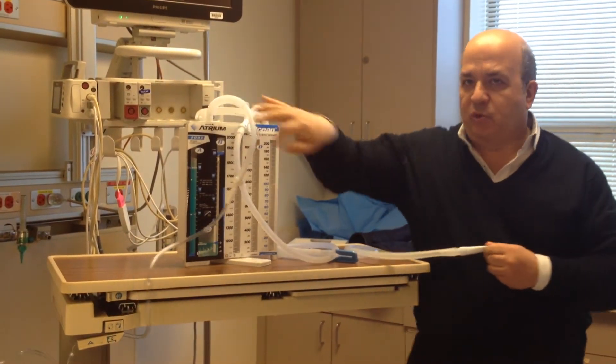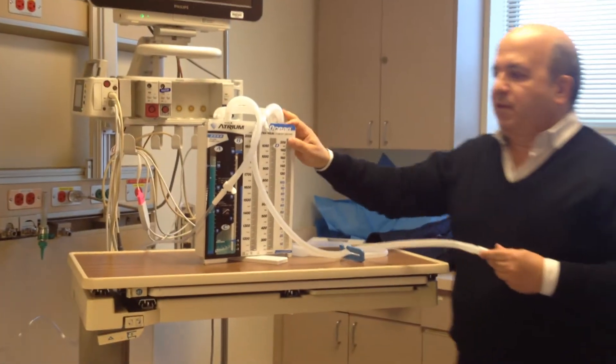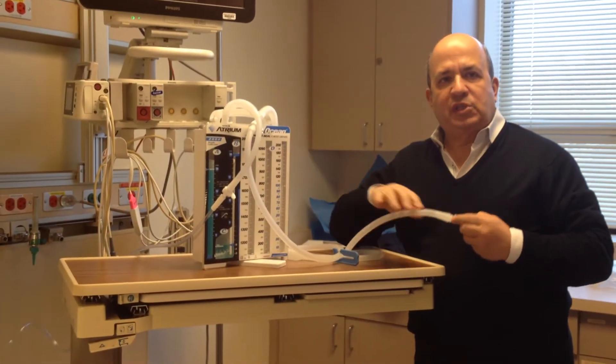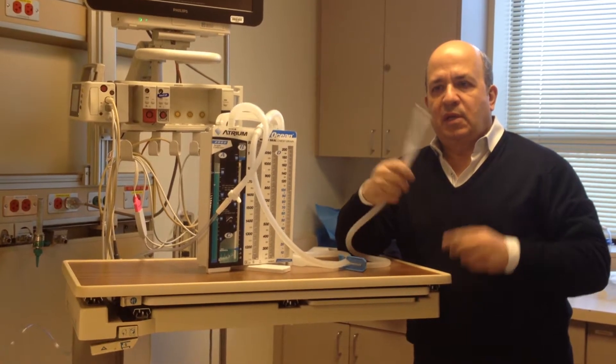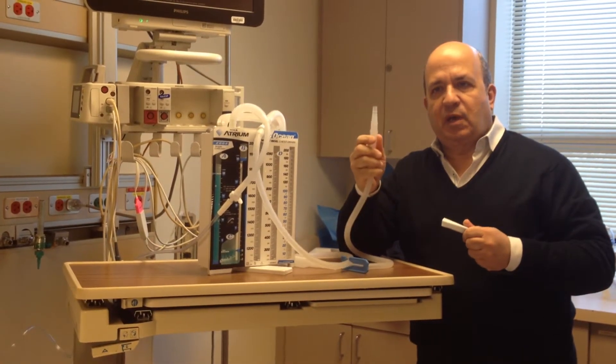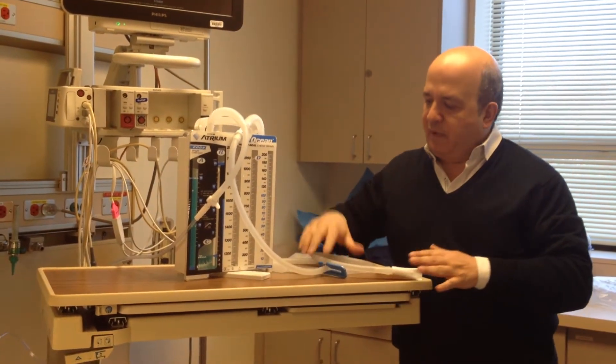When someone's going to put a chest tube in, you guys are going to have to fill this up. The only sterile part of this whole setup is the tip of this connector. So you set everything up and you keep it just like it is.